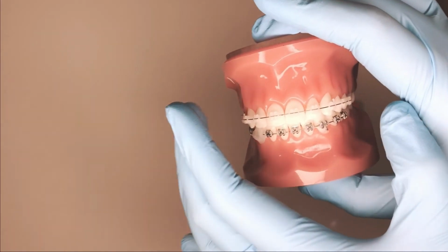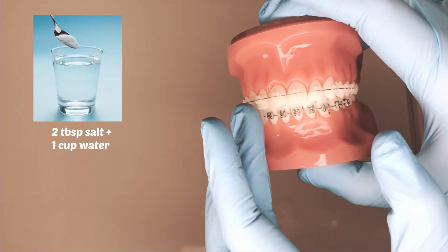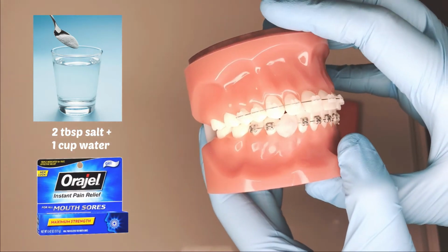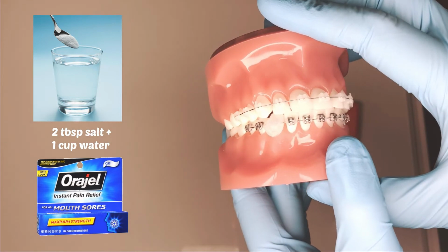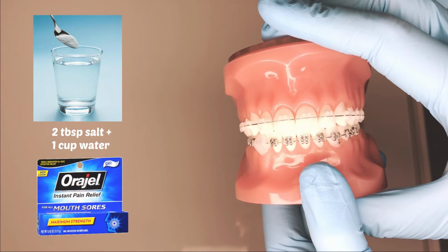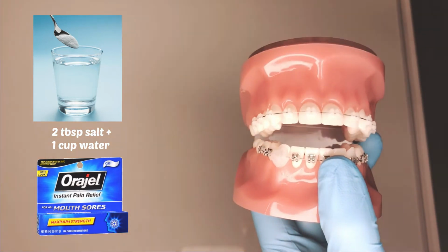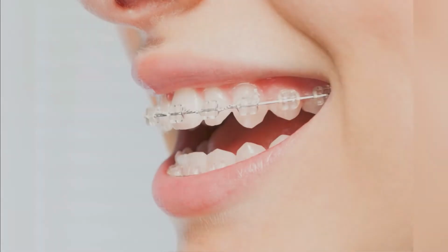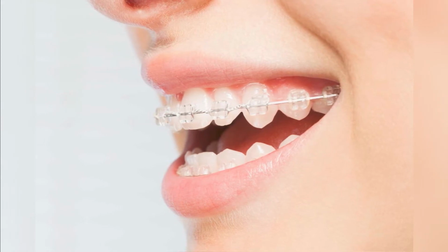If you didn't use wax in time and a sore has developed on the inside of your mouth, you can rinse with warm salt water and use Orajel if it's really painful. You can get Orajel over the counter and it will numb the sore spot temporarily. You should still use wax to coat the braces while your mouth is healing, which may take up to 2 weeks to fully heal.